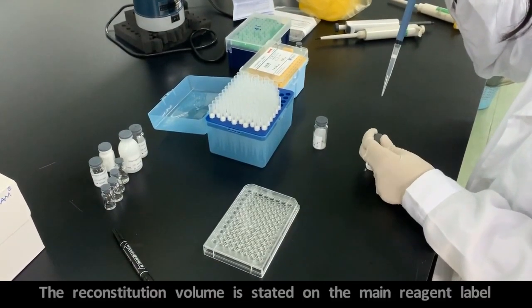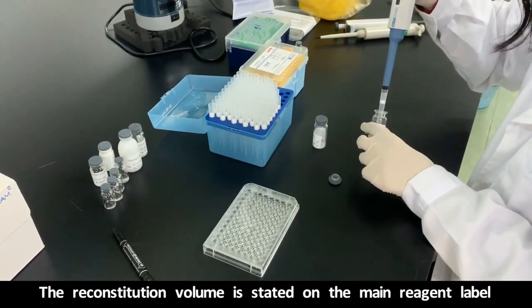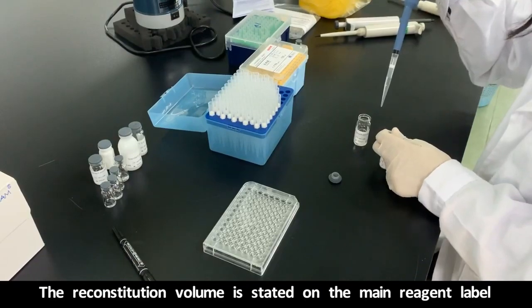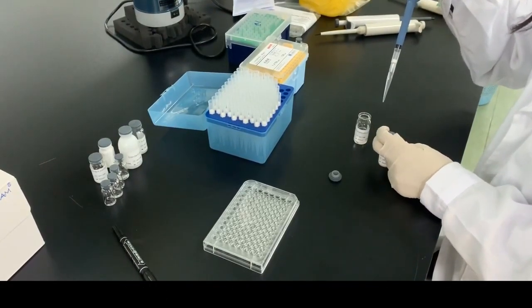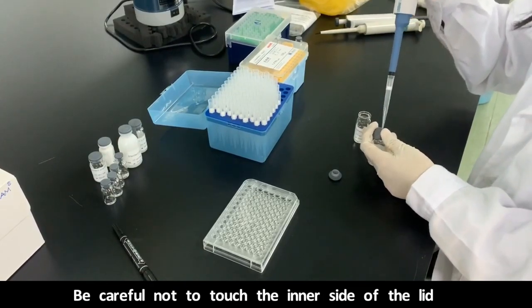and this is mixed to produce enough reagent for all of the assay.